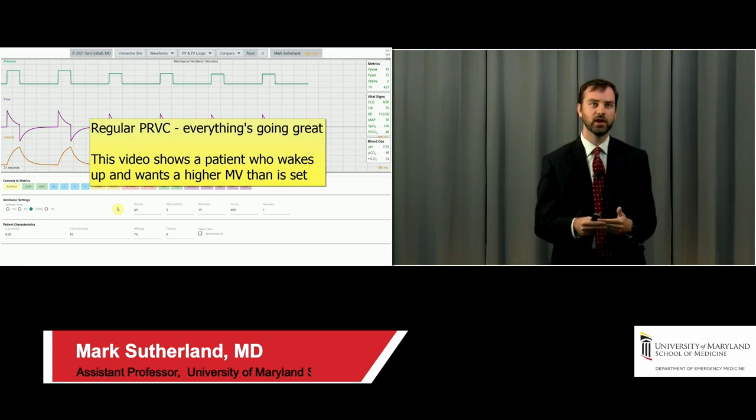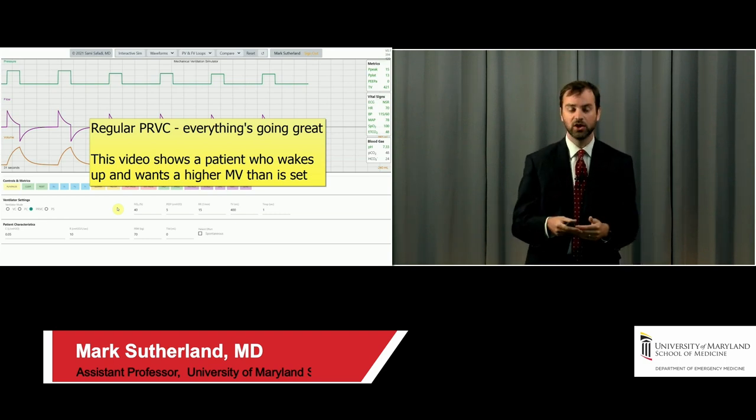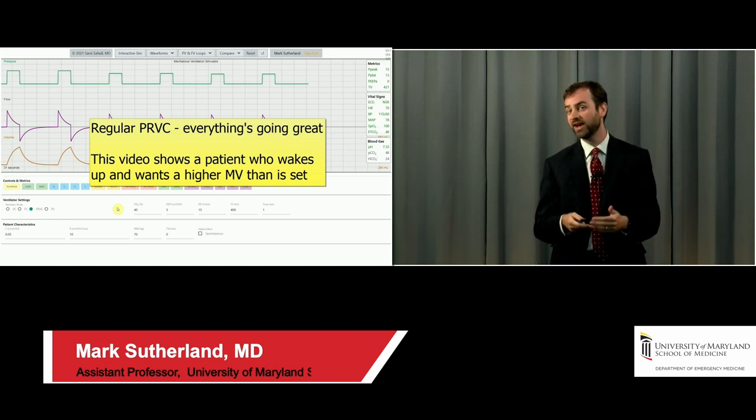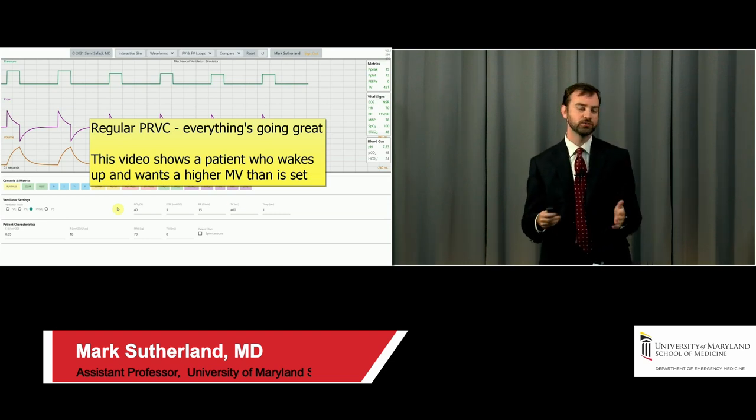And of course, for any of you who have been up in an ICU, and same thing in our EDs, when patients are intubated and when they wake up, they tend to be what we call air hungry, right? They tend to want higher respiratory rates and higher minute ventilations than we're giving them.